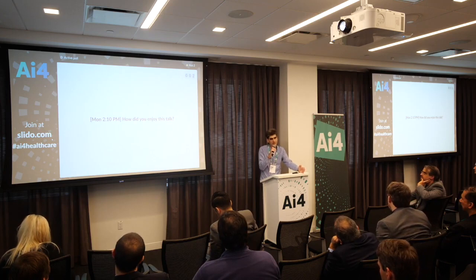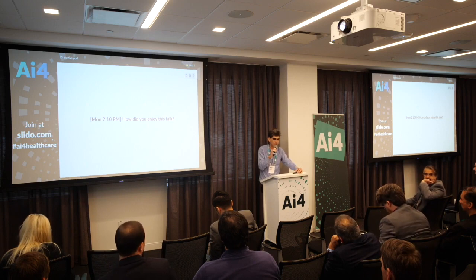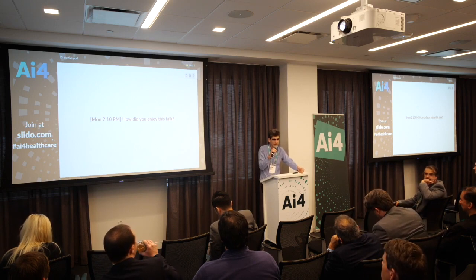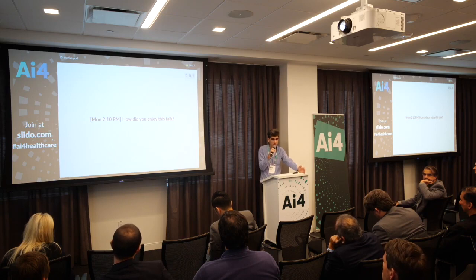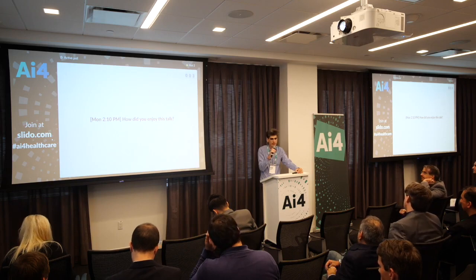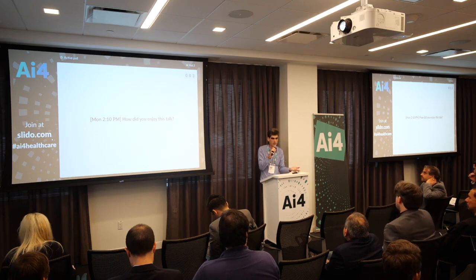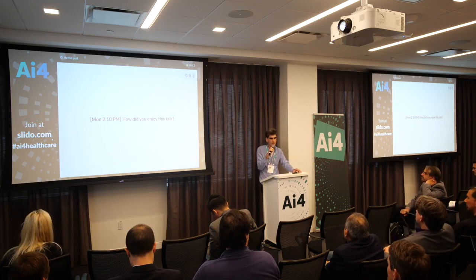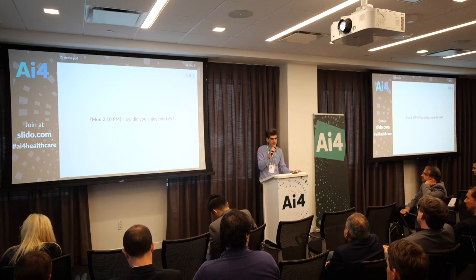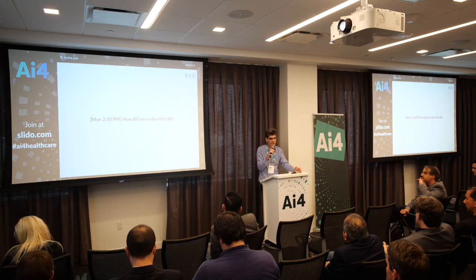If the data set is big enough, and big enough does not have to be all that big for this kind of classification task, maybe it's not measured in the tens or hundreds of thousands, it's probably measured in the thousands to get a good result. Could be less. Then you need to balance the training data appropriately. You don't want to train your network on a completely unbalanced data set, so you can throw only some of the negative examples at it. If you have a decent amount of examples of the cells you're trying to classify, then the imbalance in the data set can be overcome, and the wealth of negative examples can be an advantage. It doesn't have to hurt.